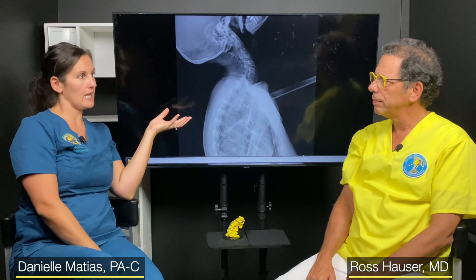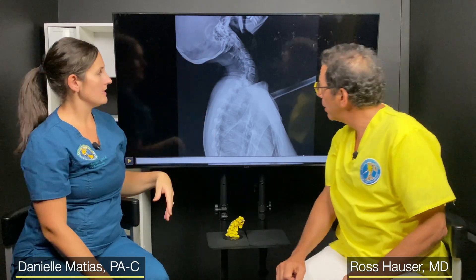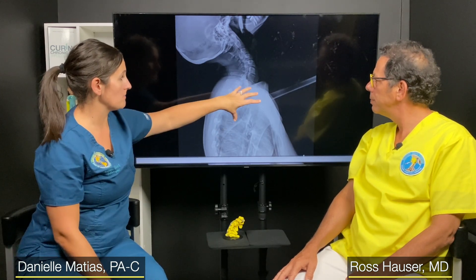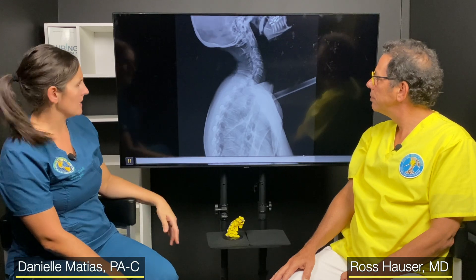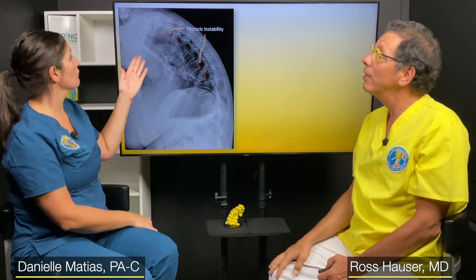For this x-ray view we have people put one arm out to clear up the cervicothoracic area, and then have them do flexion and extension. You can see whether there's instability or the opposite — where a segment becomes hypomobile or more fixed while the neck is more unstable. What I like is we can slow this way down — the patient isn't moving this slowly in real life, but we can freeze it and get pictures of different segments to see what's moving and what's not.